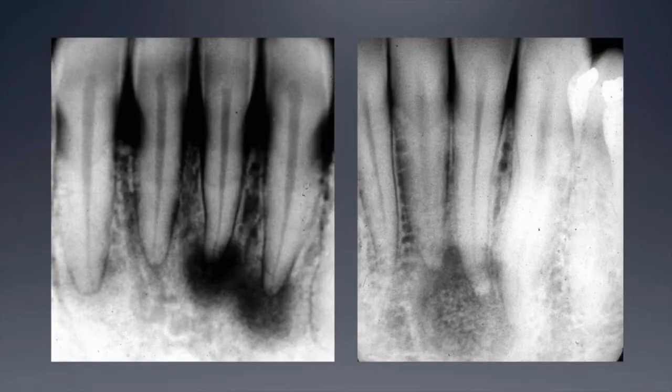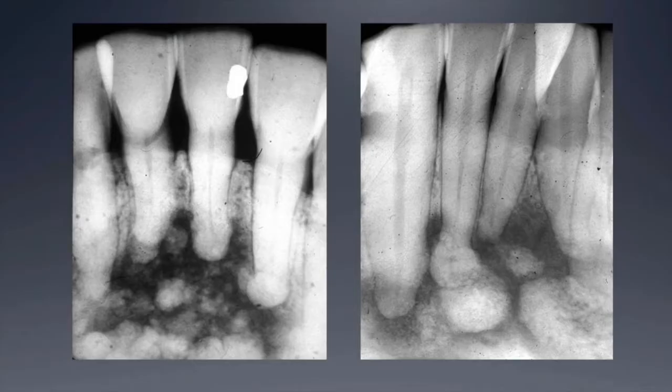I think for anybody who knows this field, the other element that they're going to notice is that there are multiple lesions. So vital teeth, periapical lucencies, but teeth are vital. And this points to periapical cemental dysplasia, a benign entity. The teeth should remain untouched because this is what happens later on: they calcify the lucencies and they become opaque.